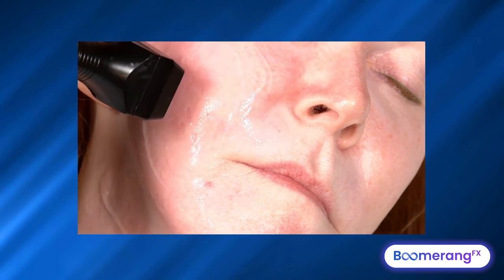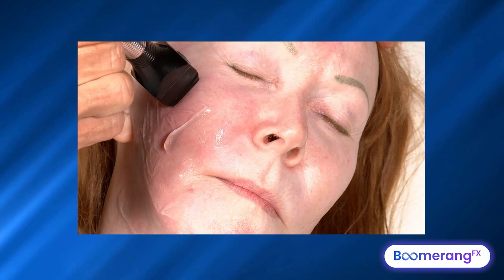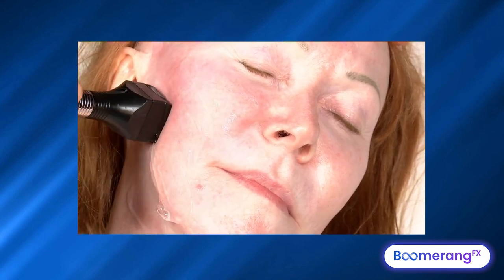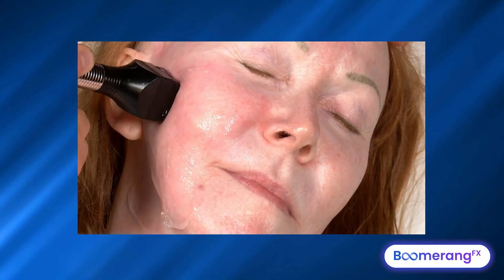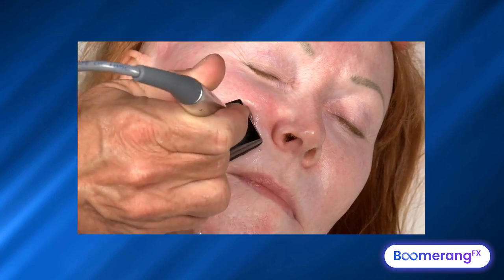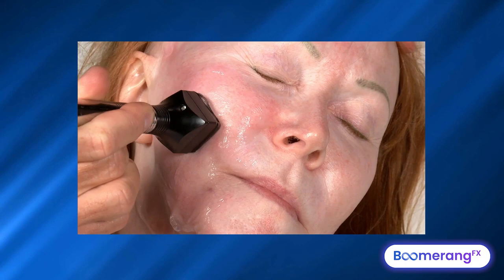We start doing moving bulk heating RF, positive to negative. Basically, we're bulk heating the entire nasolabial fold, labiomental fold, and under the eye — slowly and gently right over the skin we already treated with IPL and over the skin we treated with the Morpheus. Typically we do IPL, Forma, and Morpheus in that order — one, two, three — with the Morpheus last.